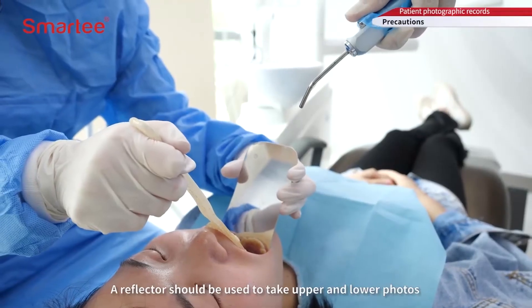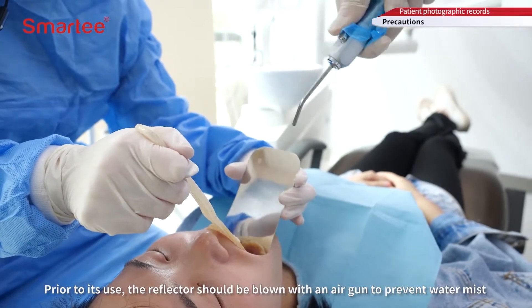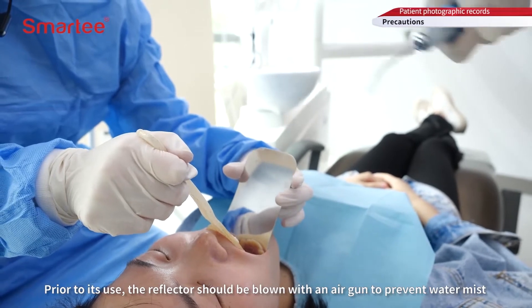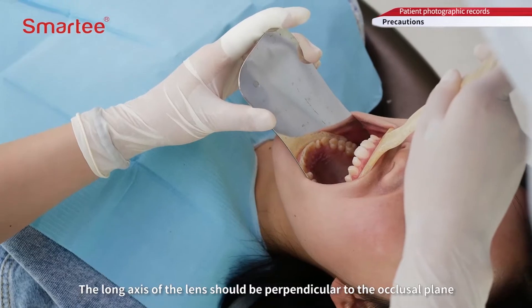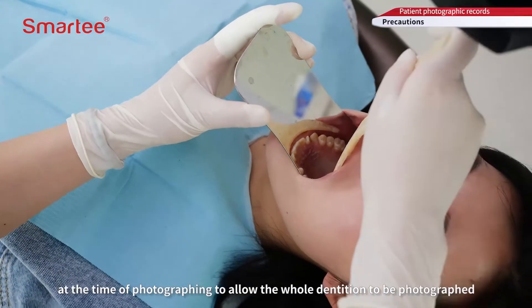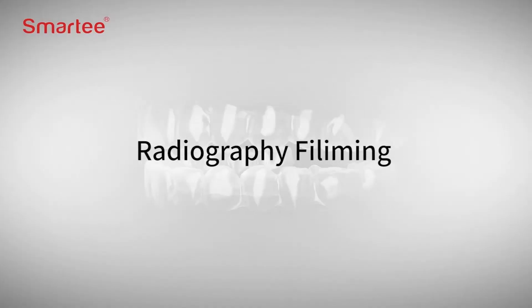A reflector should be used to take upper and lower photos. Prior to its use, the reflector should be blown with an air gun to prevent water mist. The long axis of the lens should be perpendicular to the occlusal plane at the time of photographing, to allow the whole dentition to be photographed.